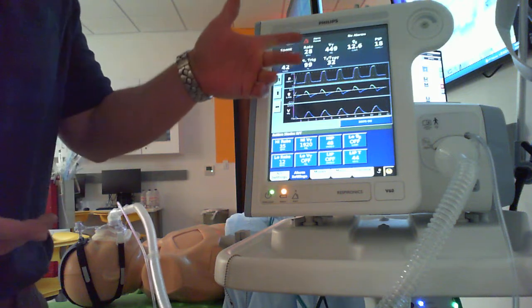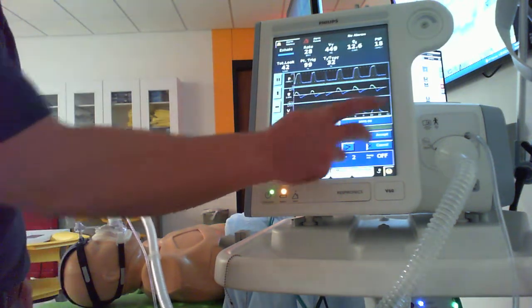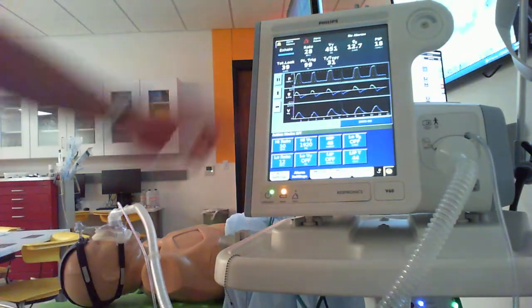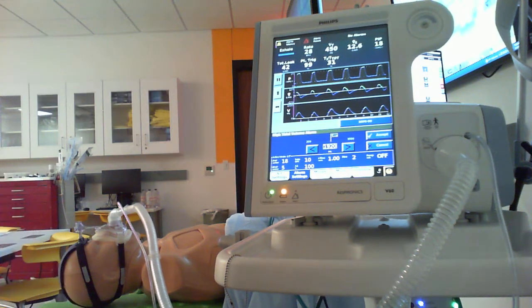If you wanted to set it at 30, that's fine too, but once again, it's pretty tight, all right, but you could do so, and it's just touch, turn, touch. You could use a little quick access wheel and the check mark up there too if you don't like tapping so much. High tidal volume, we know these tidal volumes are estimated, they're not exactly measured, okay, and they're going to vary a little bit.